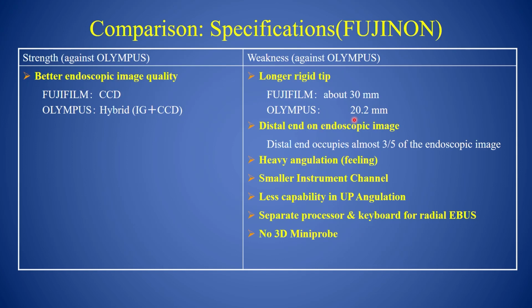So head-to-head comparison, why am I comparing with Olympus? Because most of the scopes which are available are probably Olympus. Most of us have probably trained also on Olympus.